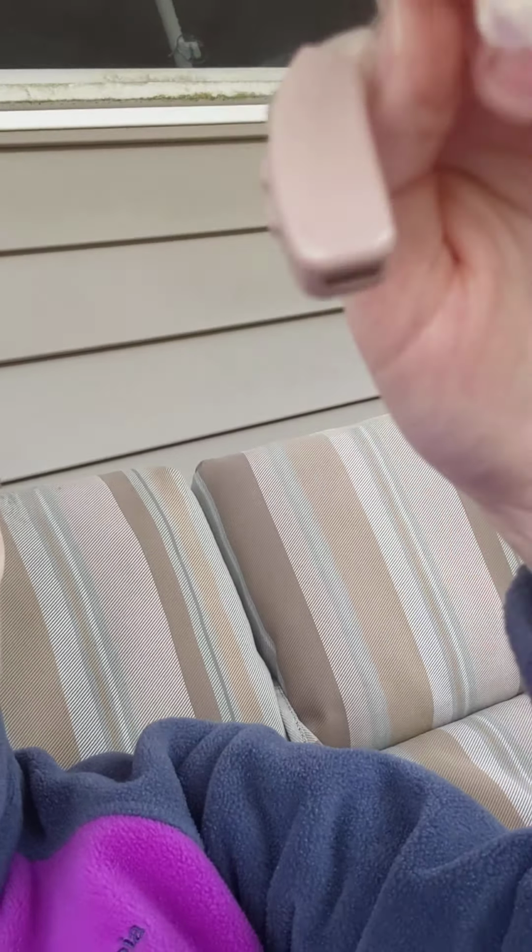So I will show you the hearing aid, but basically I like how you can turn it on and off. So no batteries, no losing batteries. I don't have to spend money on batteries. I just put in my hearing aids each day and go. So let me show you. I don't know if it'll squeak. I'm going to try to show you the best I can. I'm outside and now I can't really hear myself. I'm sorry, I'm not trying to get too close, but I'm doing this video on my own. So being blind, it's a little hard.